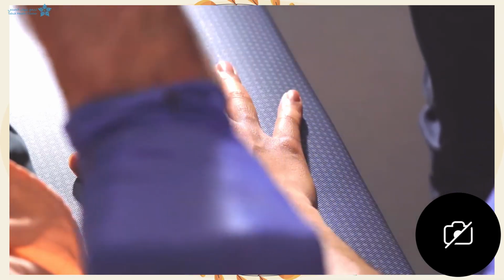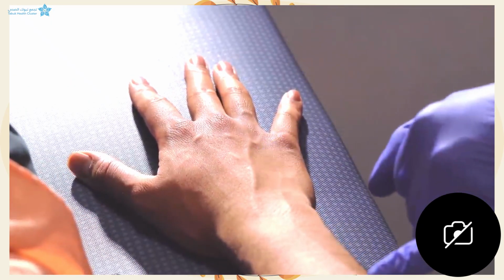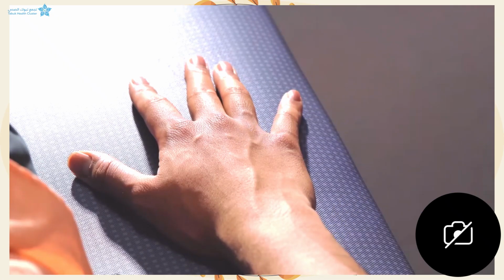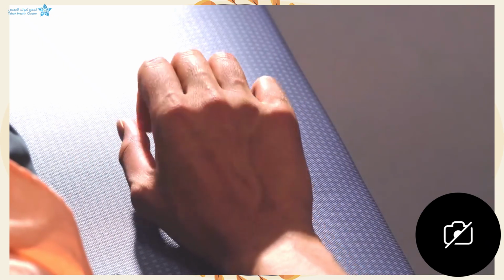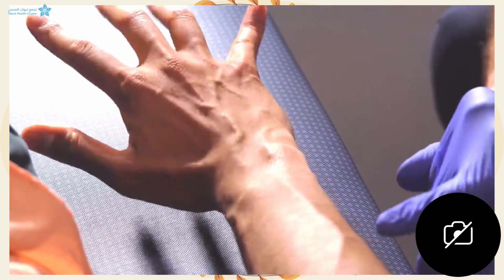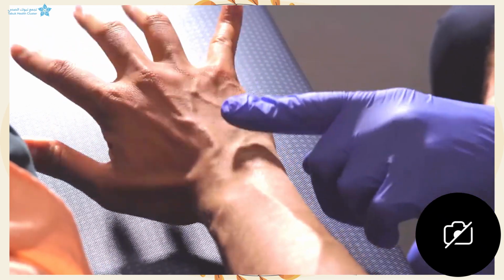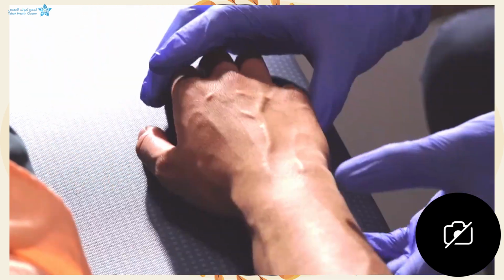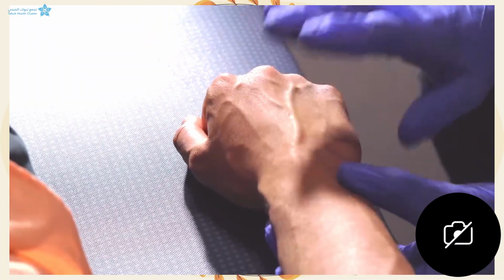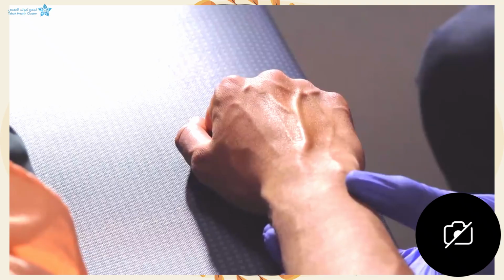So if I put that back on again, then we start to have a look to see what we can find. We can see the veins, yes, but what we need to do is find veins that are easily palpable. You can get the patient to flex their hand, and that can bring some of these veins to the fore. We could get the bifurcation here in the wrist. Some patients prefer that because it leaves the hand free. We can tap on the wrist a couple of times, and that can bring the vein to the fore.